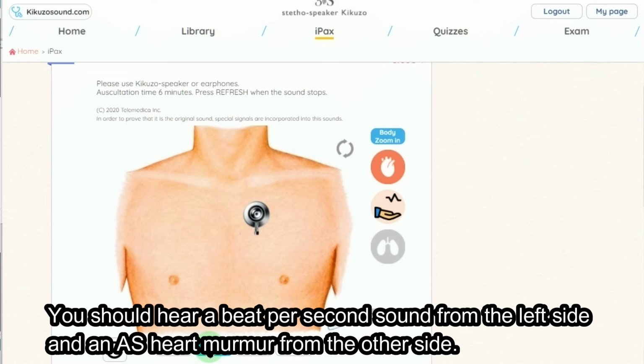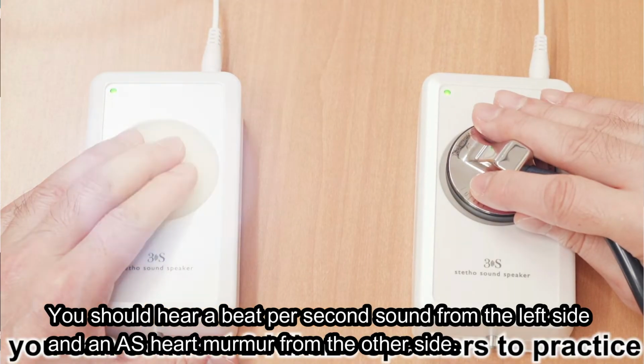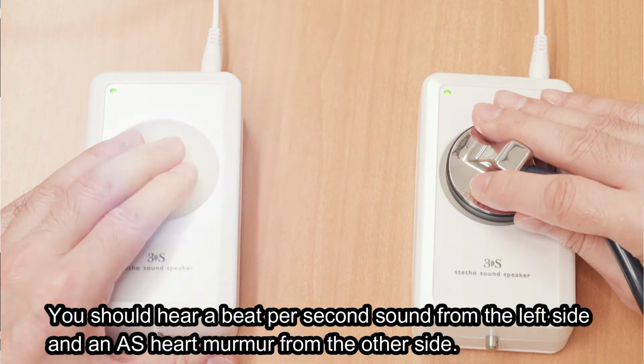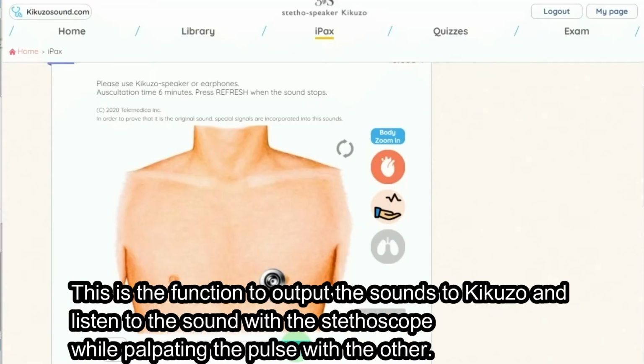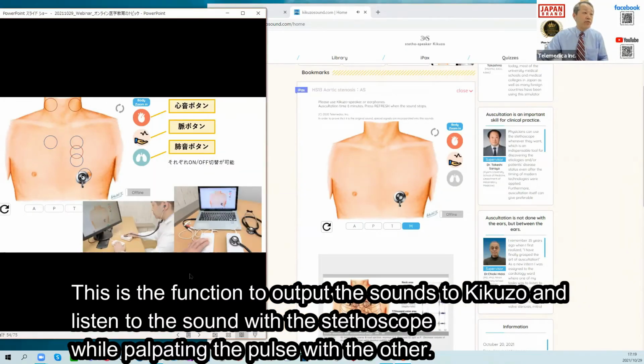You should hear a beat per second sound from the left side and an AS heart murmur from the other side. This is the function to output the sounds to Kikuzo and listen to the sound with the stethoscope while palpating the pulse with the other.